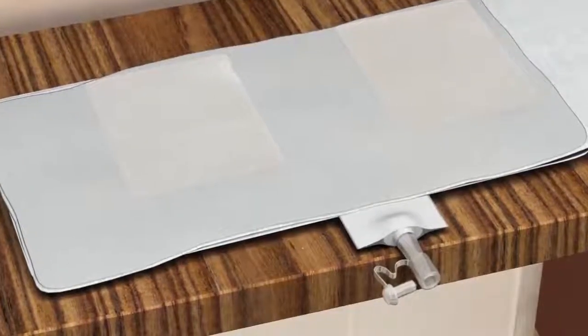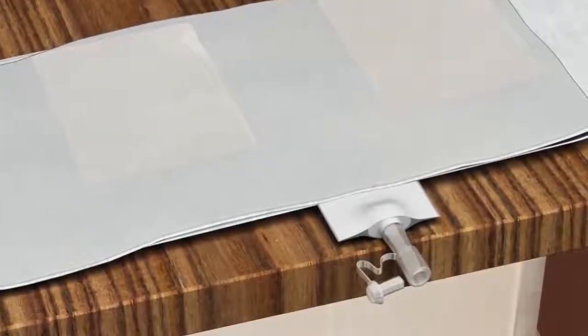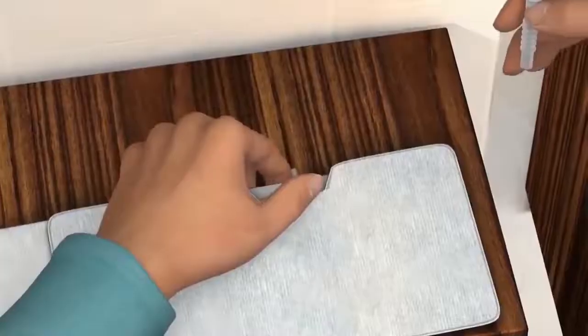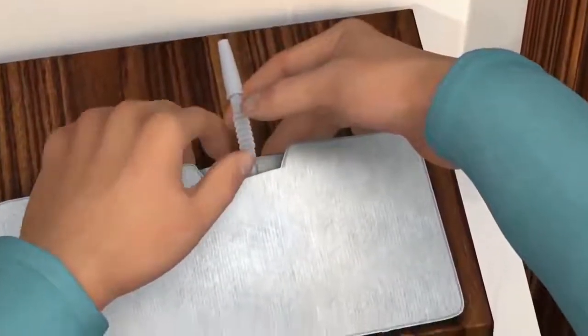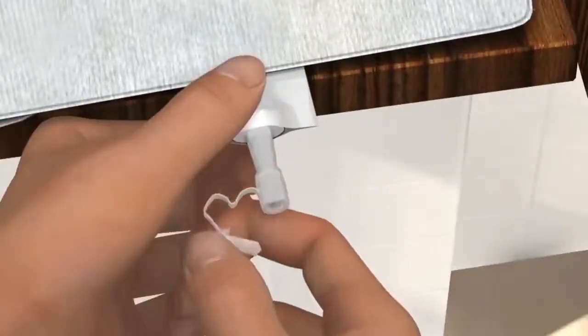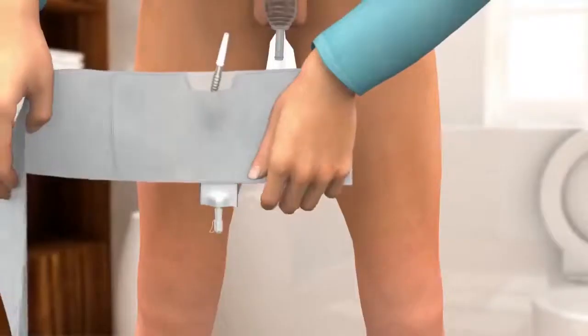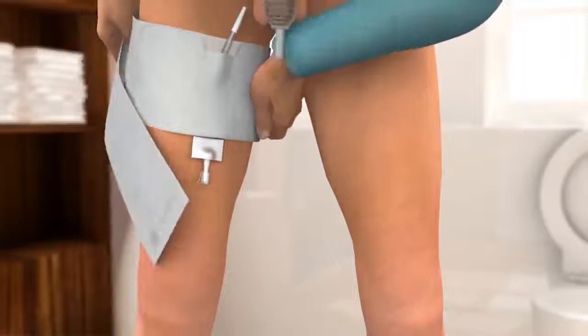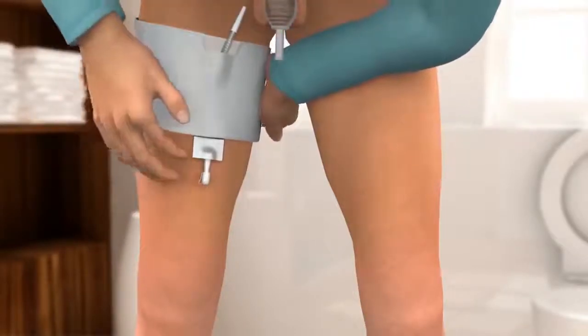Unpack and unfold the urine bag. The bag is for daytime use and has a capacity of 250 millilitres. Connect the tube with the inlet valve at the top of the bag. Close the outlet tap. Remove the protective film from the two adhesive patches on the back side of the bag. The bag is designed to be worn on the right thigh, but it can also be used on the left thigh. Hold the bag with the inlet connector pointed upwards and the outlet tap pointed downwards.